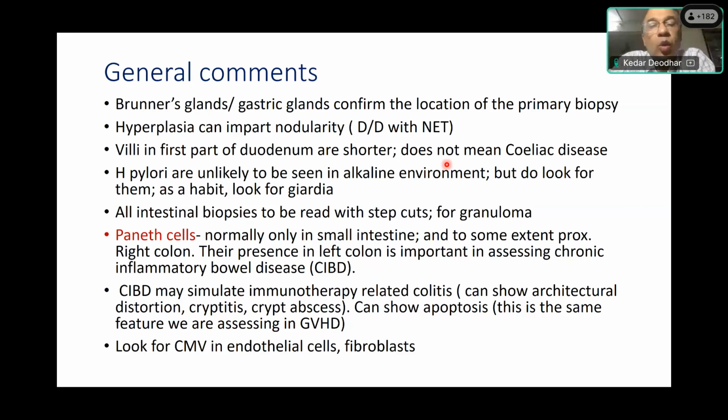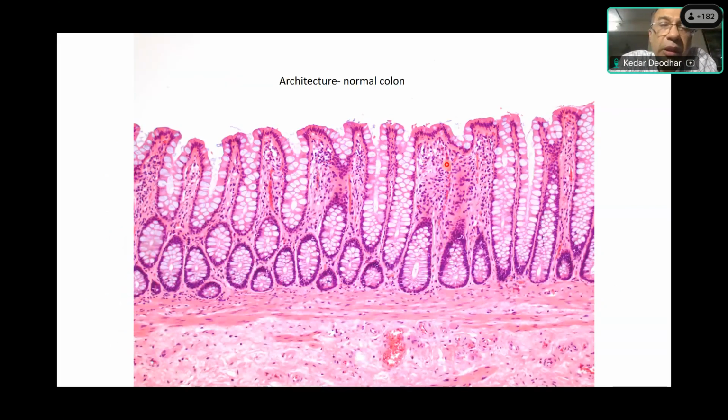So in normal colon, we have the mucosa, which is typically described as having test tube-like features. The crypts are arranged parallel to each other, and this is the normal appearance. When this is disturbed, or we have bifid or branching crypts, then we call it architectural distortion.